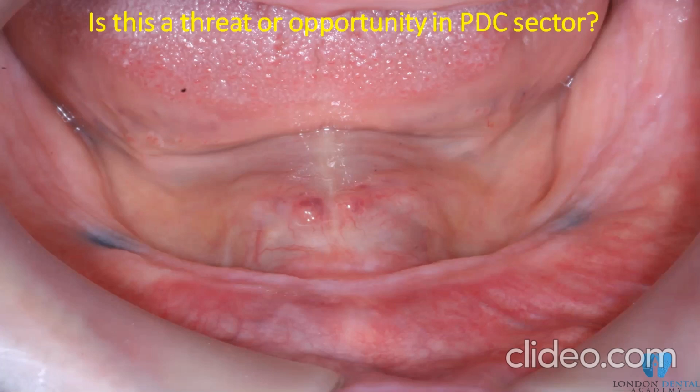But, and here's a big but, please don't try to do two sides at the same time, otherwise you won't be able to get it out, because having undercuts on either side becomes difficult. So I do one side. If I'm happy, I do a little on the other side, just to guarantee good retention. If I'm really happy with one, it's enough for me, because otherwise you will end up with massive trauma on either side. Although it's retentive, stable, and strong, the patient will come to you many times in the morning and in the afternoon, and disrupt your schedule because they suffer from pain, discomfort, and trauma.